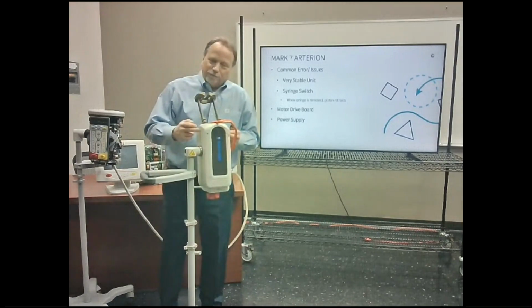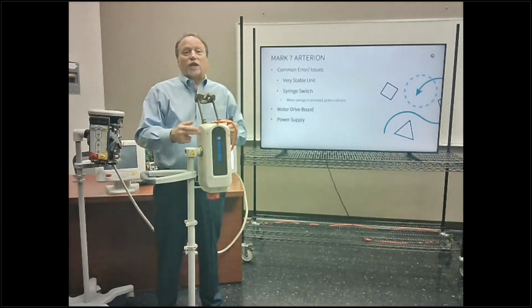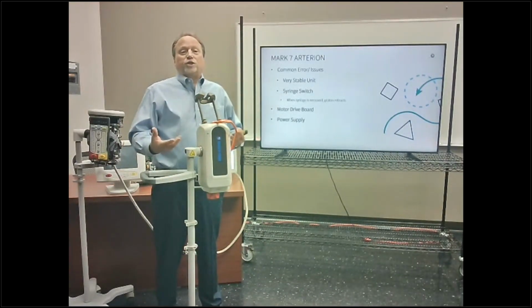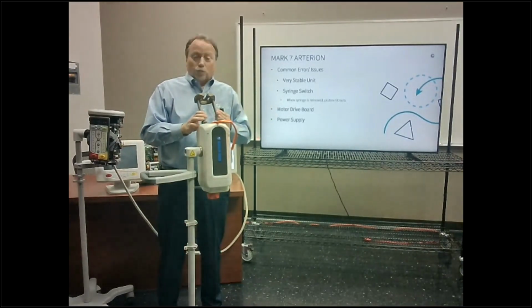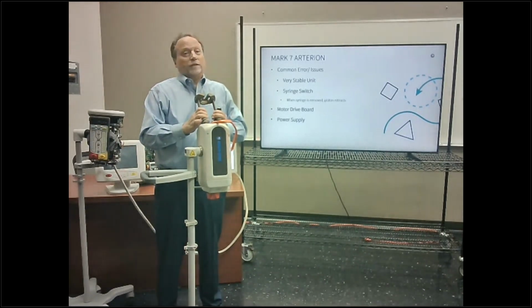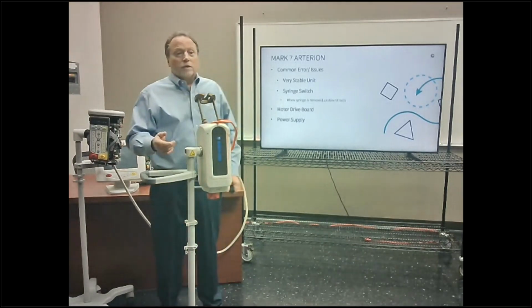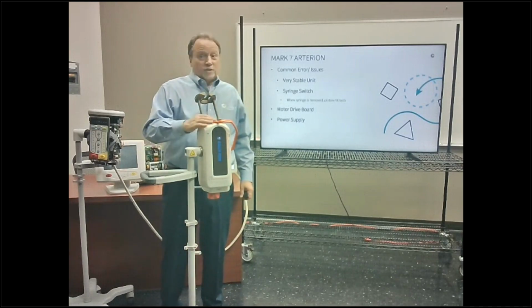Motor drive boards, it's right in front here, right on the display. It handles a lot. It handles power and a lot of amperage. It gets hot and it's abused because of the amperage it takes for the injections that they use. It will wear out and it will fail. Not hard to replace and not very expensive either. Like I said, they actually did a good job on this head. And you'll get a motor drive error, and that goes straight to that board. And pretty much, this head is very solid.